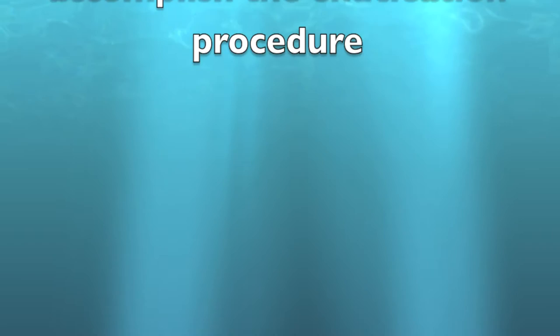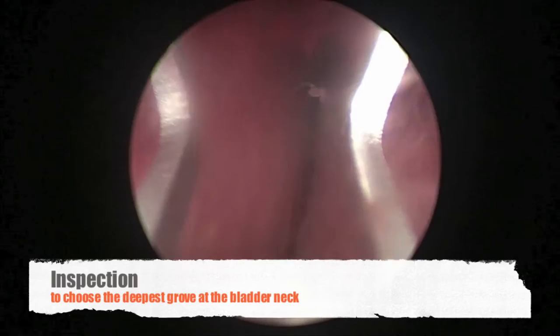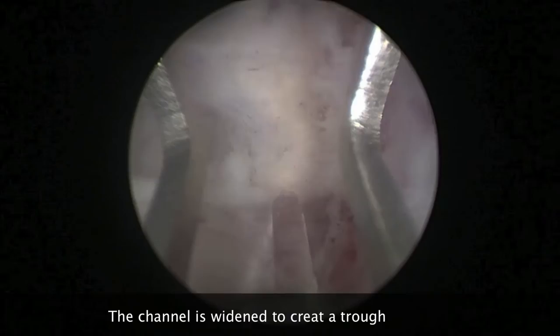The HoLEP procedure starts by creation of a working channel from the bladder neck to just lateral to the verumontanum. We start the procedure by careful inspection of the prostate anatomy, looking for the groove at the bladder neck where we have to start our incision. The incision is made at the bladder neck and extending deep to the surgical capsule. The created working channel is widened to create a trough underneath the lateral lobe.